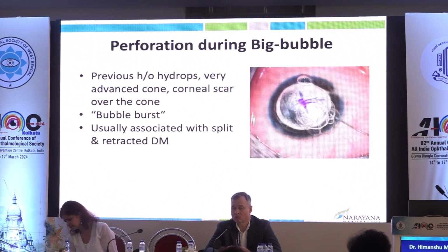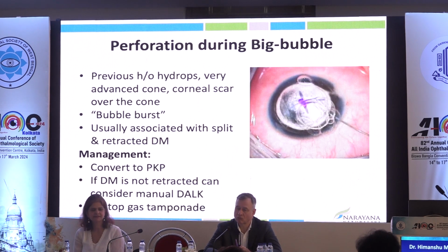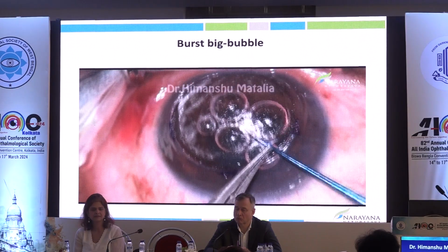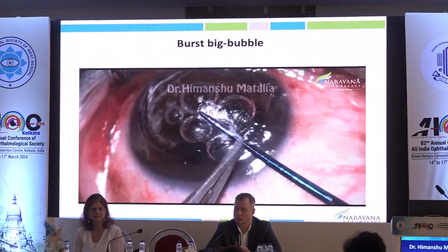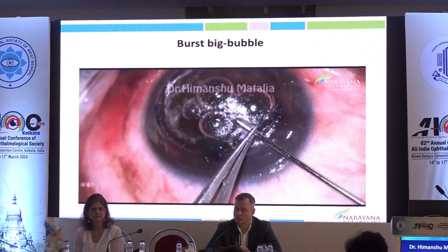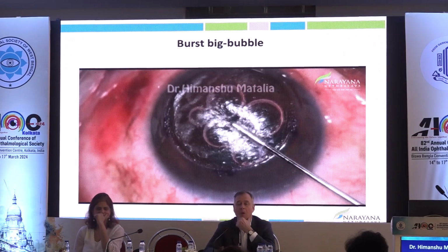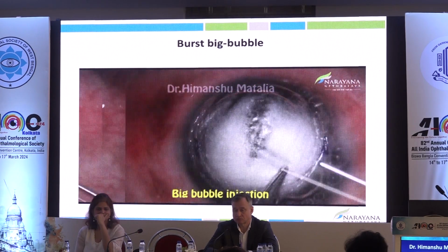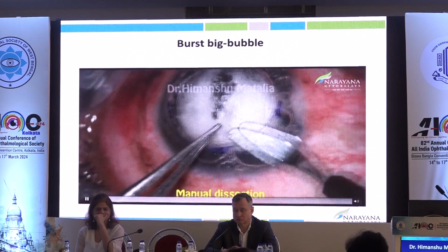Sometimes we hear a unique pop sound when we are doing a big bubble DALK, you are injecting the big bubble, the big bubble gives way and you hear a pop. In one such case, I was making a groove on the cornea, and once the groove was made, I decided to make the big bubble. I don't know whether you can hear it, but the video has a pop there, and I heard the pop and knew, okay, it's gone. You could also see multiple bubbles in the anterior chamber.